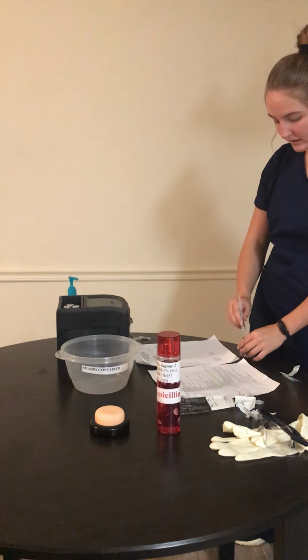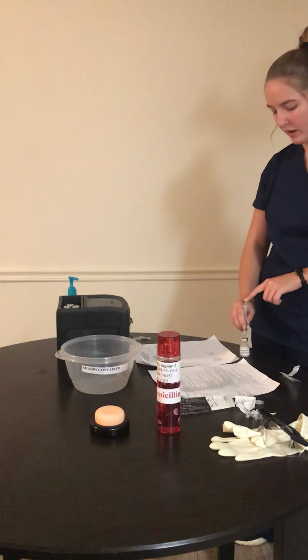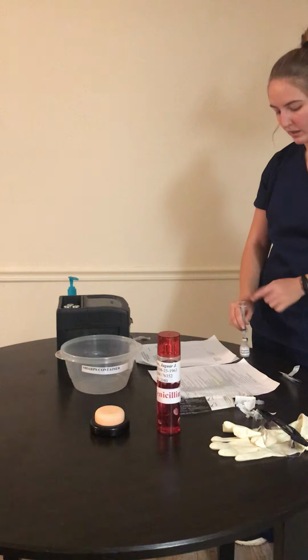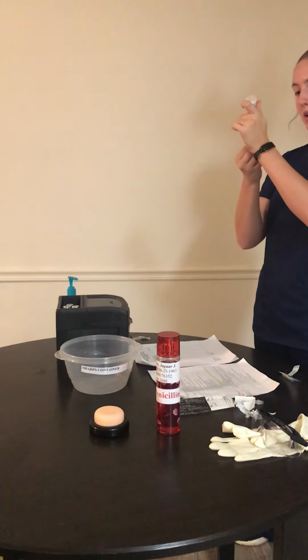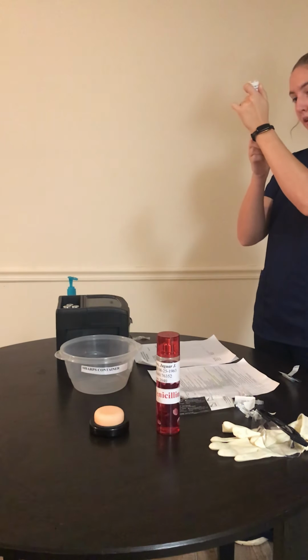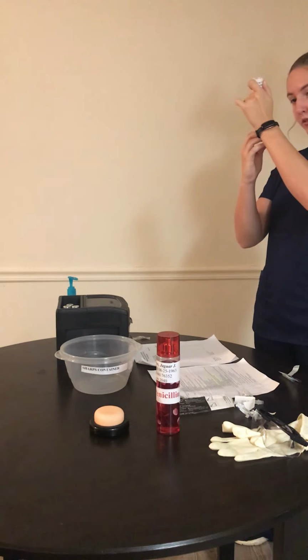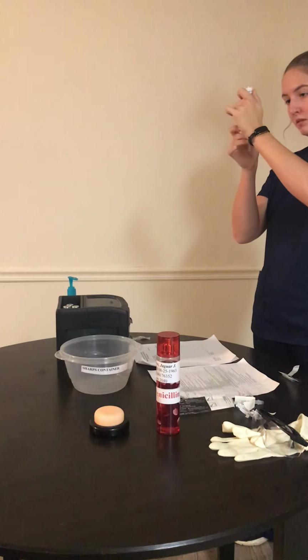I will place this into the morphine sulfate and push in my air. I'm going to withdraw half a milliliter of solution, and I'm going to get rid of any bubbles.